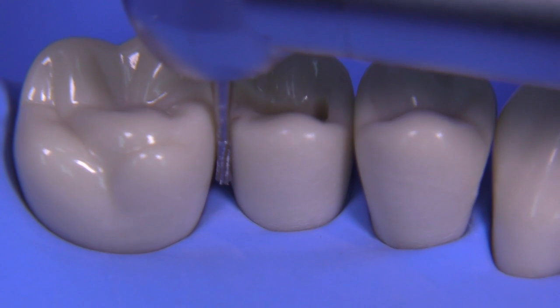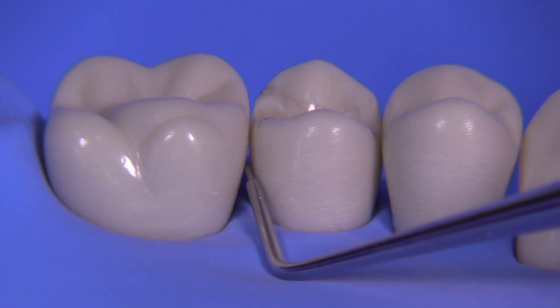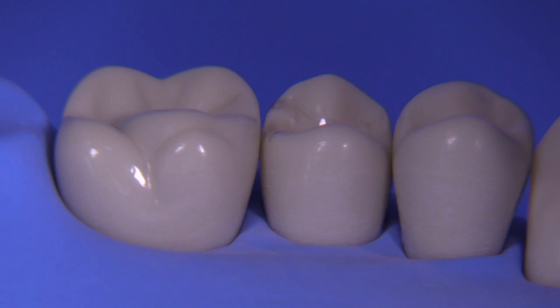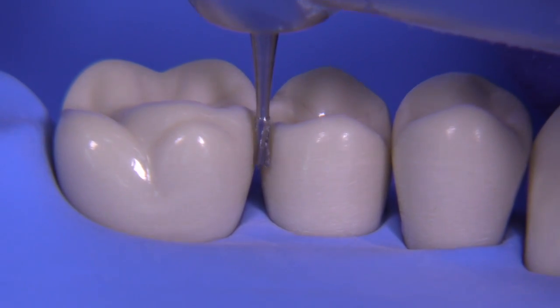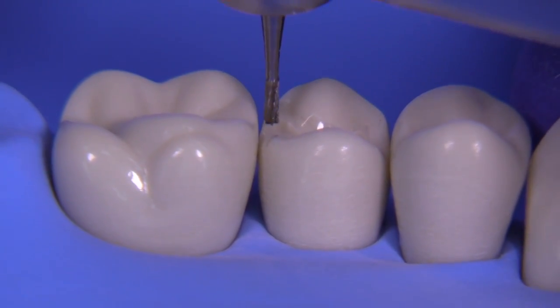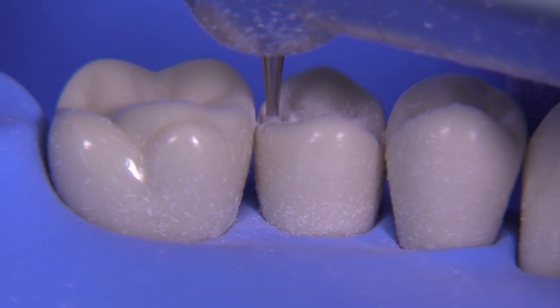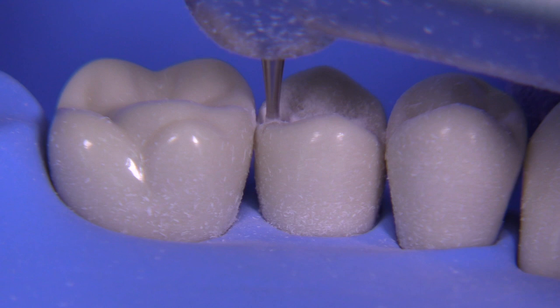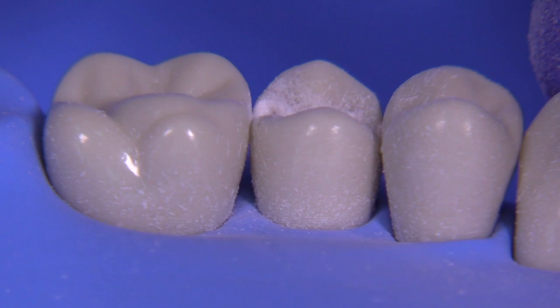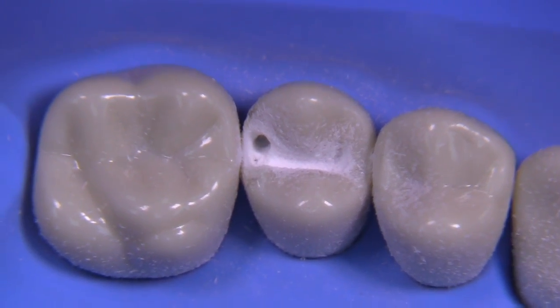Here we are with the 245 burr. I like to hold the burr up along the side of the tooth and get an idea how far gingivally I need to extend in order to break contact at the desired amount, which would be 0.5 millimeters. I can hold the burr sideways and confirm that dropping the burr down to the depth of the flutes will still be okay. I'm not trying to tip the burr — just going vertically, holding the handpiece so the burr is perpendicular to the occlusal table, and start widening this proximal area.